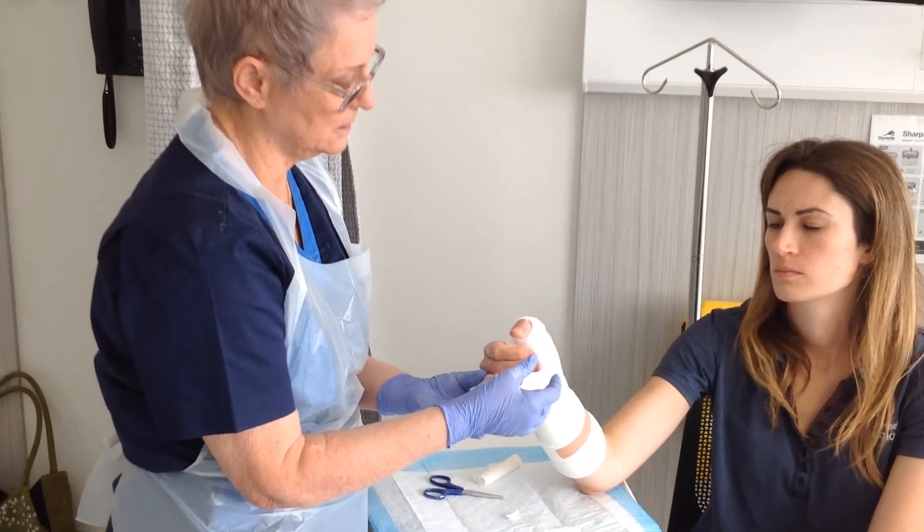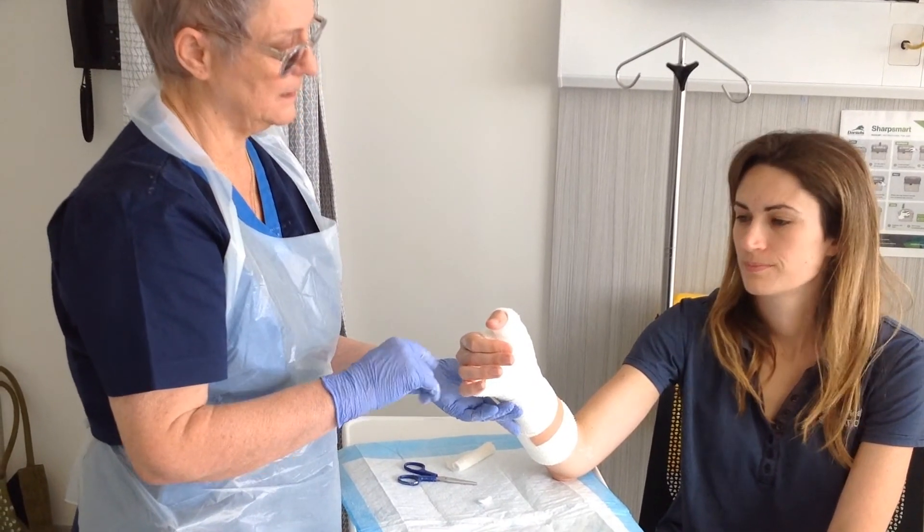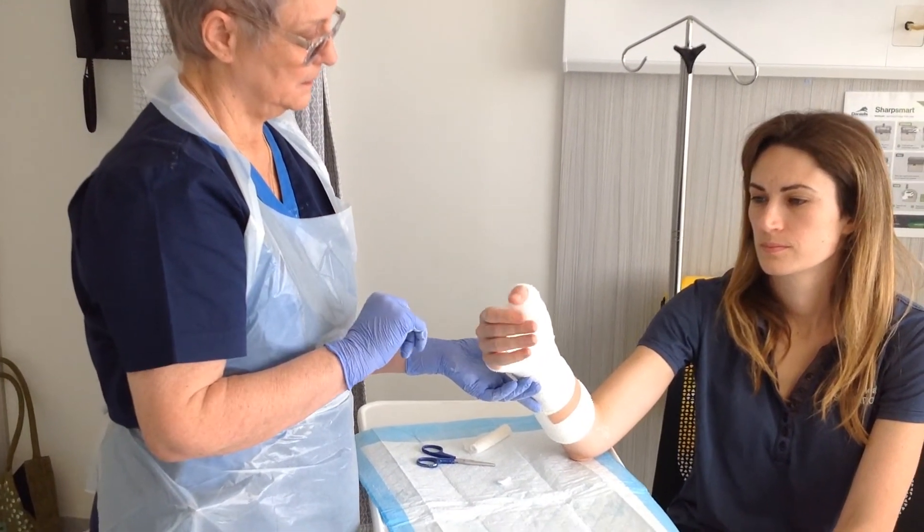The next thing we need to check is our neurovascular status — we're checking that the circulation is good, fingers are nice and warm, you can feel all sensation, and you can wiggle your fingers. And that's it.